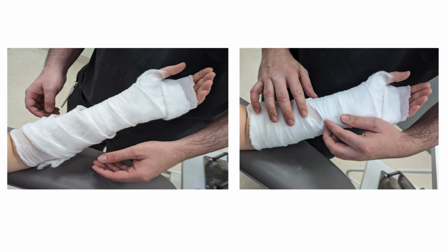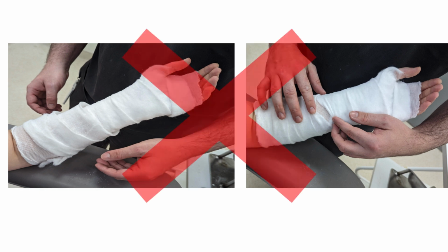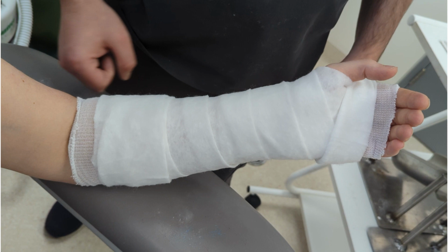Poor soft band application is a patient safety issue. Bunching up of soft band can cause pressure areas and potentially circulation issues. Areas where skin is on show between soft band will allow direct contact between the plaster of Paris and the skin. This can cause skin reactions and irritation. It is important to check your soft band application before applying the cast, as most plaster casts remain on for 2 weeks. Good soft band application is neat, tidy, firm, but not too tight.